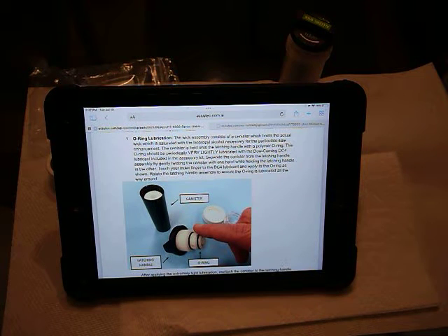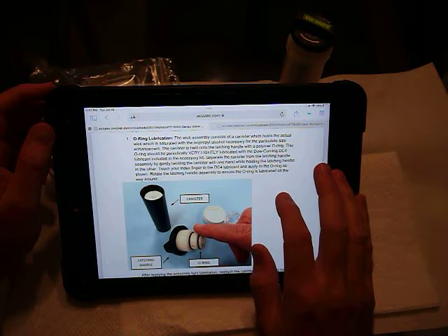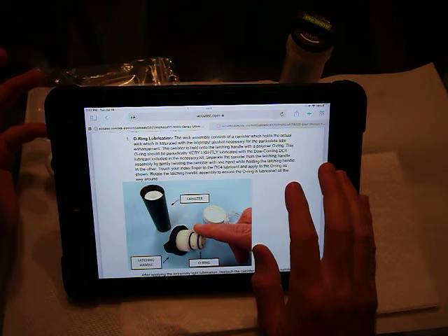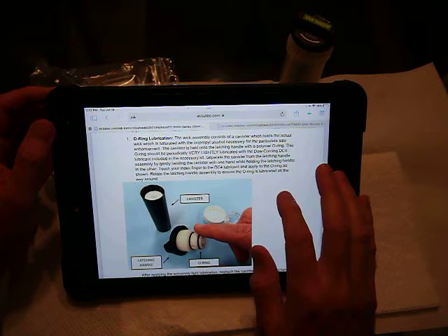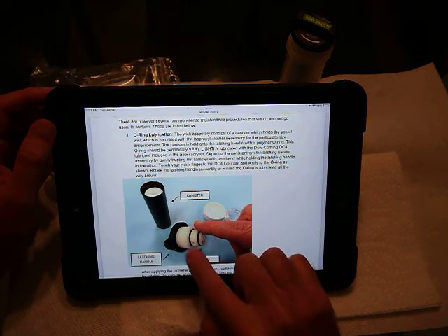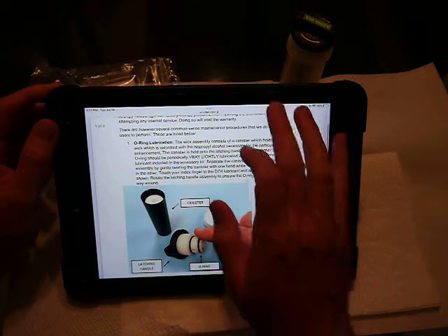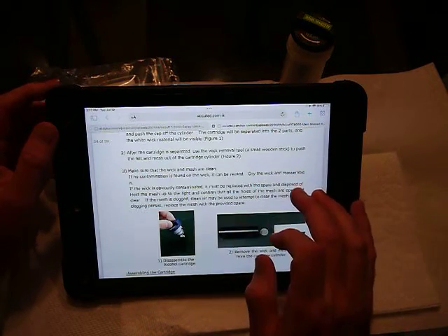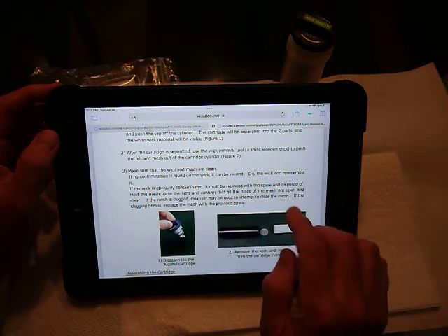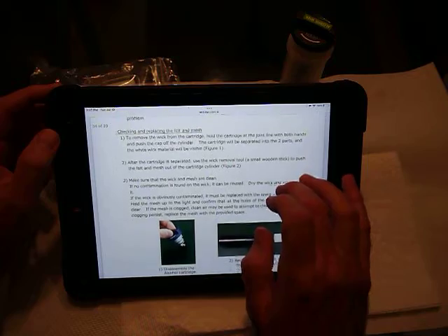Today I want to show you how to take apart the alcohol cartridge. It is outlined in a maintenance document on the support section of the Accutech website. So it's in this document. It talks about lubricating the O-rings occasionally, but it also is covered in the main manual on page 34, and it talks about replacing the felt and mesh in the alcohol cartridge.